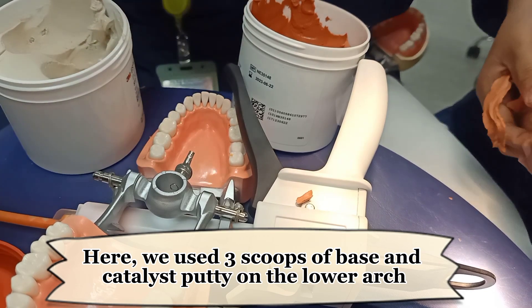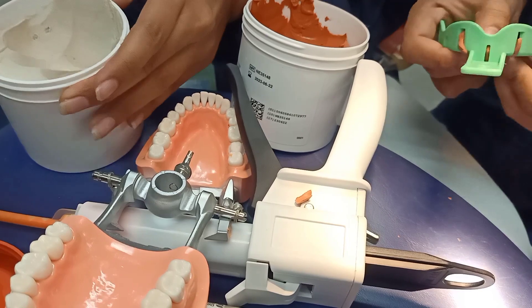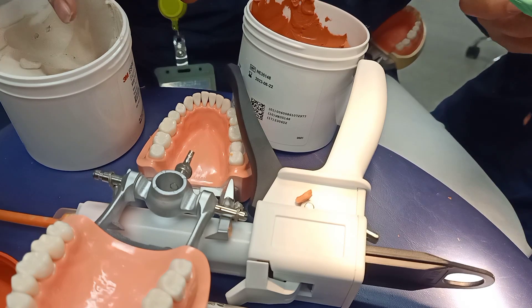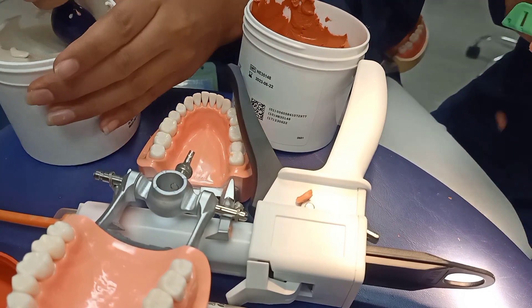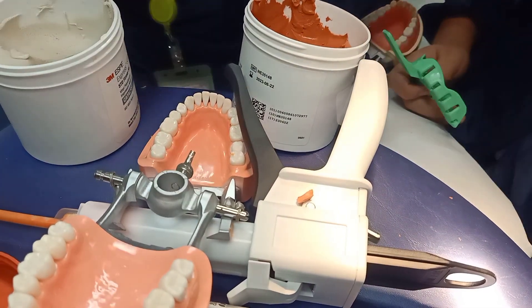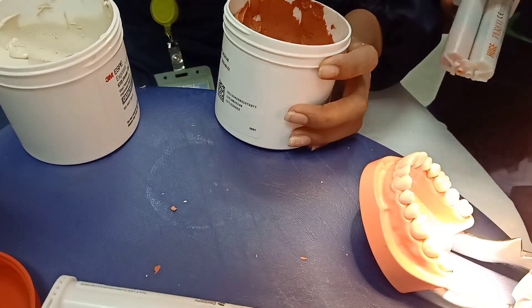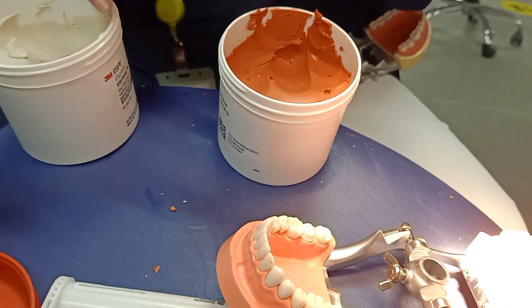We used three scoops of base and catalyst putty on the lower arch.